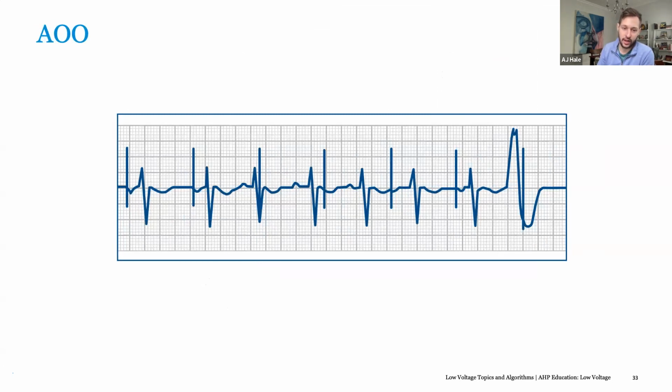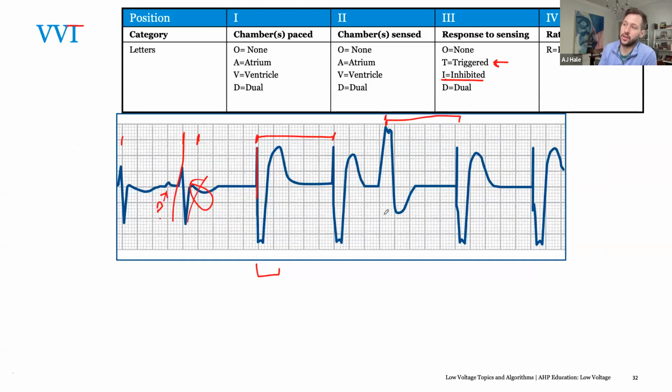If you have a patient who has occasional noise, it may be advantageous to pace into it. Say this is noise here, it may just try to pace. Just in case, if this is noise, we go ahead and depolarize the heart. And if it's not noise, and it's a true event, you just kind of fuse with it. So it's used as like a safety pace. And it's used as increasing your BiV pacing.